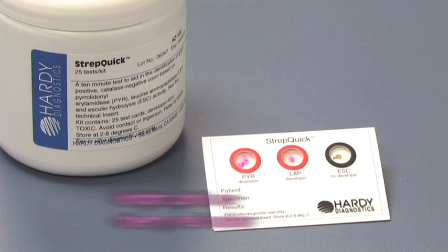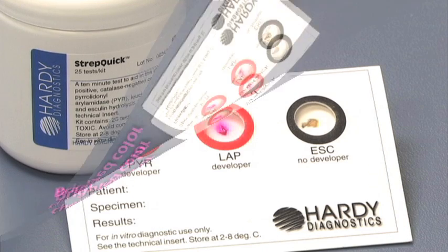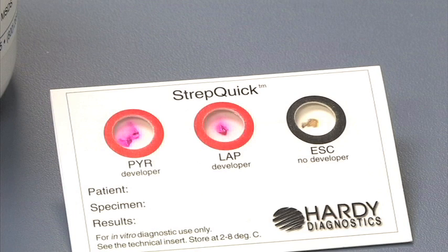Within one minute, observe for a bright pink or cherry red color within the first two circles. This denotes a positive reaction. Any other color would be interpreted as a negative.